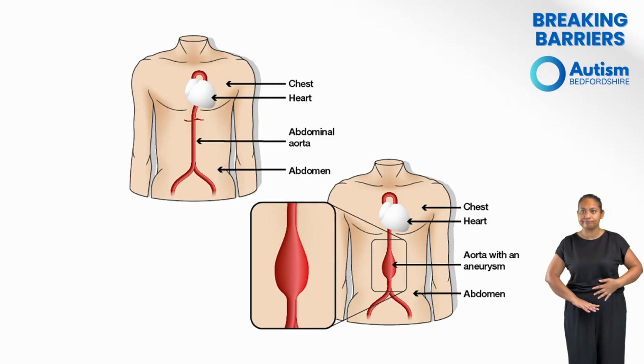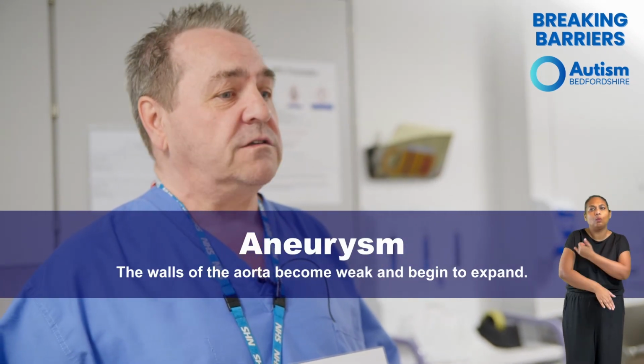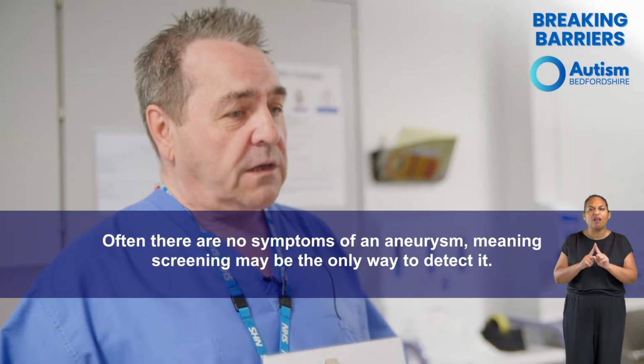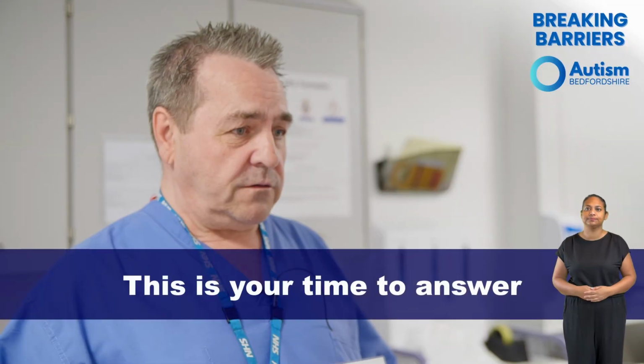Right. What we're looking for today is an aneurysm. An aneurysm is a weakening and a swelling within the walls of the aorta, and it starts to expand. Because there are no symptoms of this condition, that's why we do a scan for you today. Okay, do you have any questions?